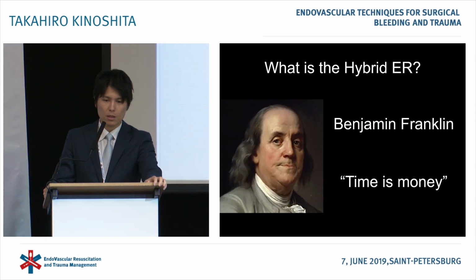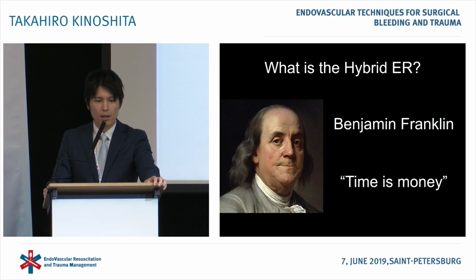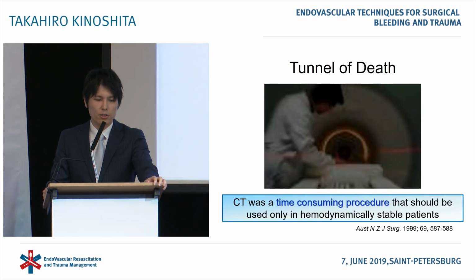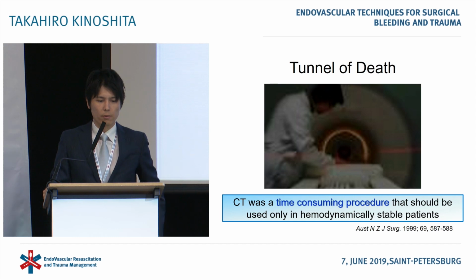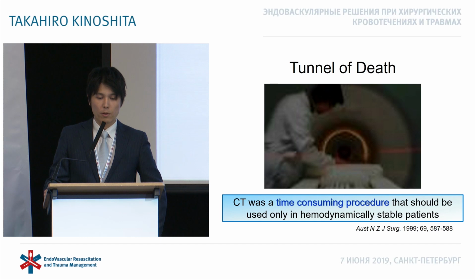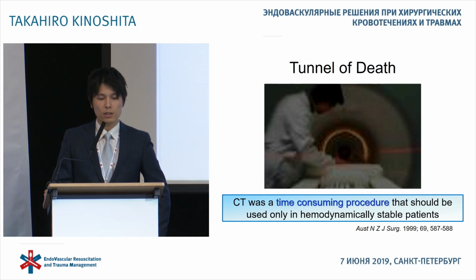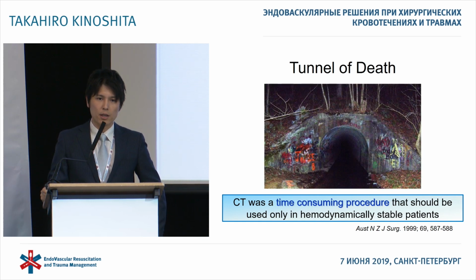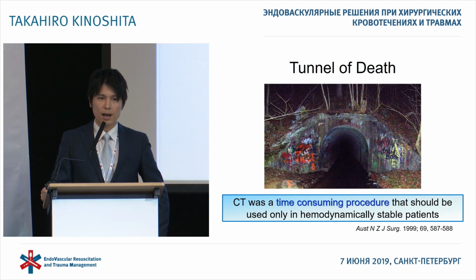Today, I want to talk about the novel trauma management system created in Japan. And let me start with the background. Twenty years ago, computed tomography was considered a time-consuming procedure. So it was considered to be used only in hemodynamically stable patients. It is also called tunnel death because many severe trauma patients died on the CT table.